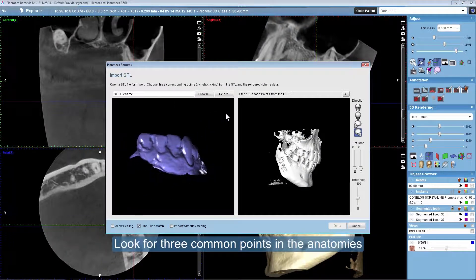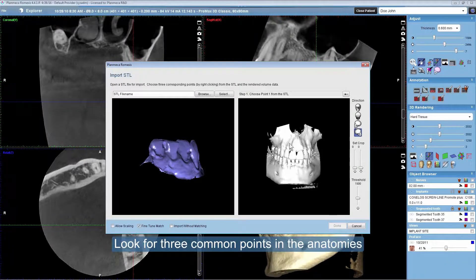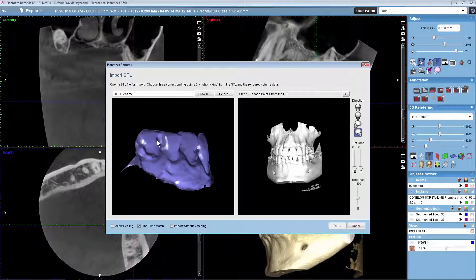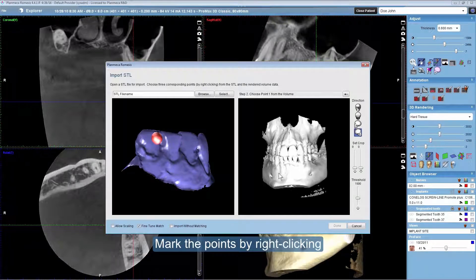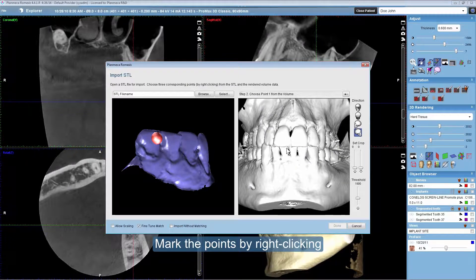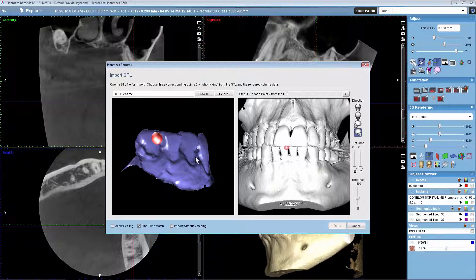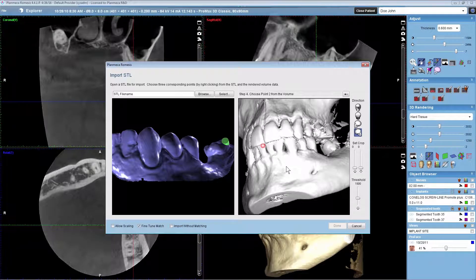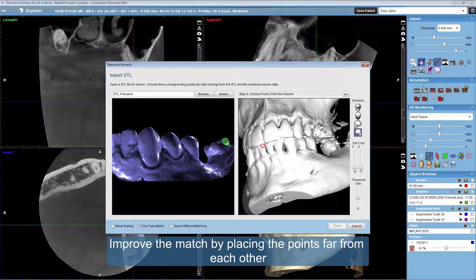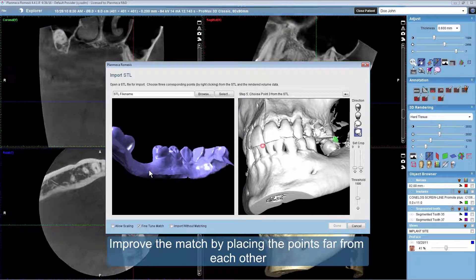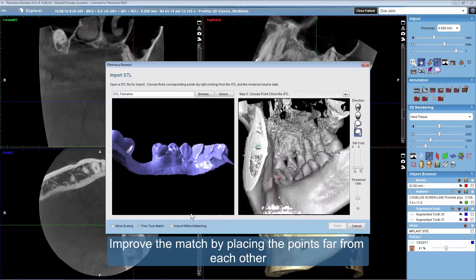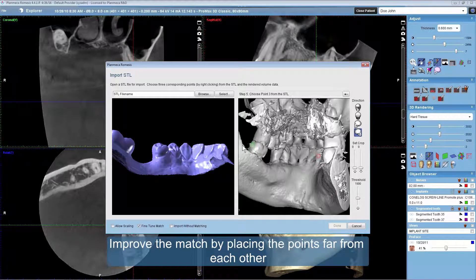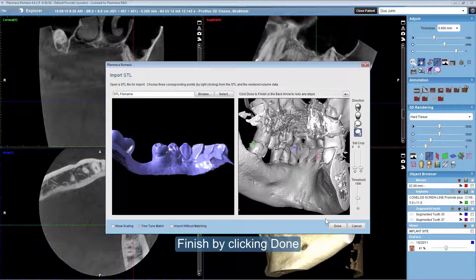Look for three common points in the anatomies. Mark the points by right-clicking. Improve the match by placing the points far from each other. Finish by clicking Done.